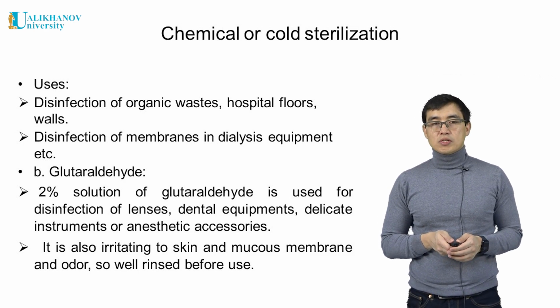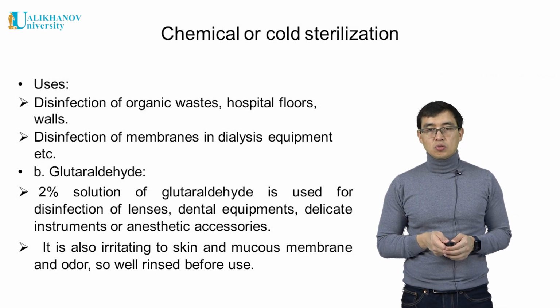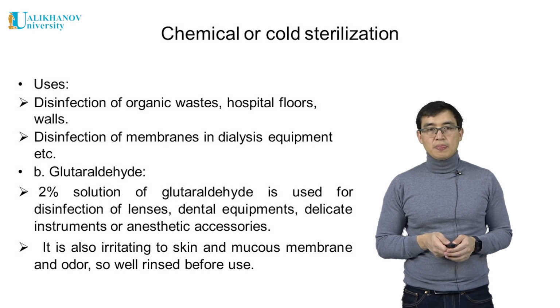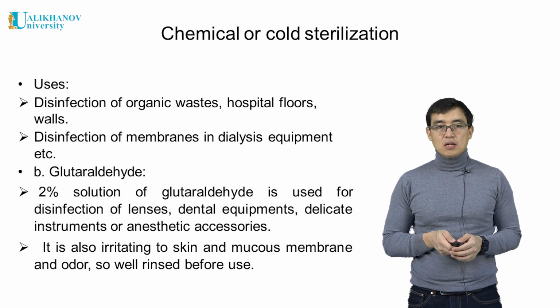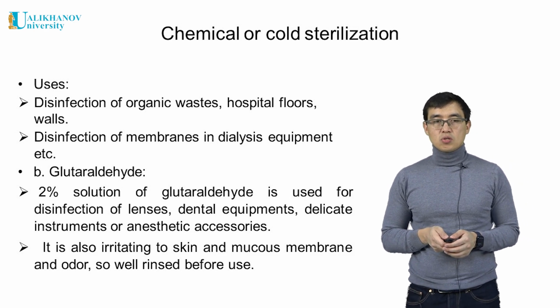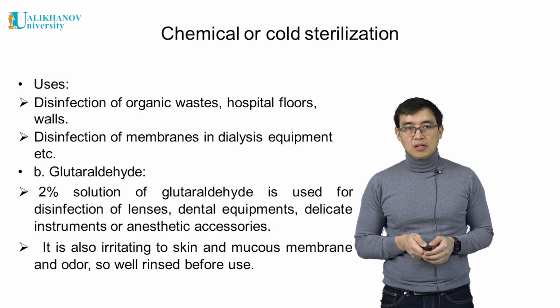Glutaraldehyde: a 2% solution of glutaraldehyde is used as a disinfectant for lenses, equipment, delicate instruments or anesthetic accessories. It is also irritating to skin and mucous membrane and has an odor, so it should be used with care.